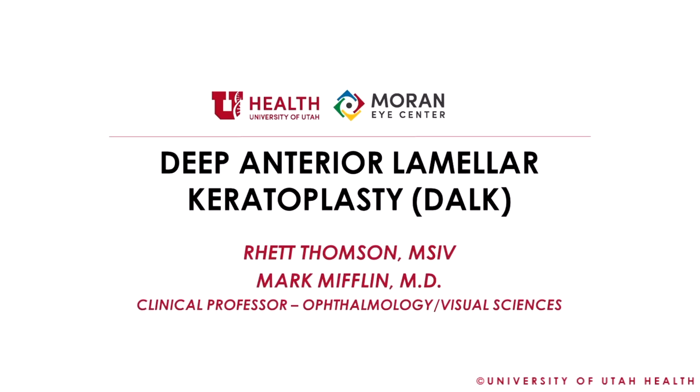Welcome to this surgical video on deep anterior lamellar keratoplasty, performed by Dr. Mifflin at the Moran Eye Center.